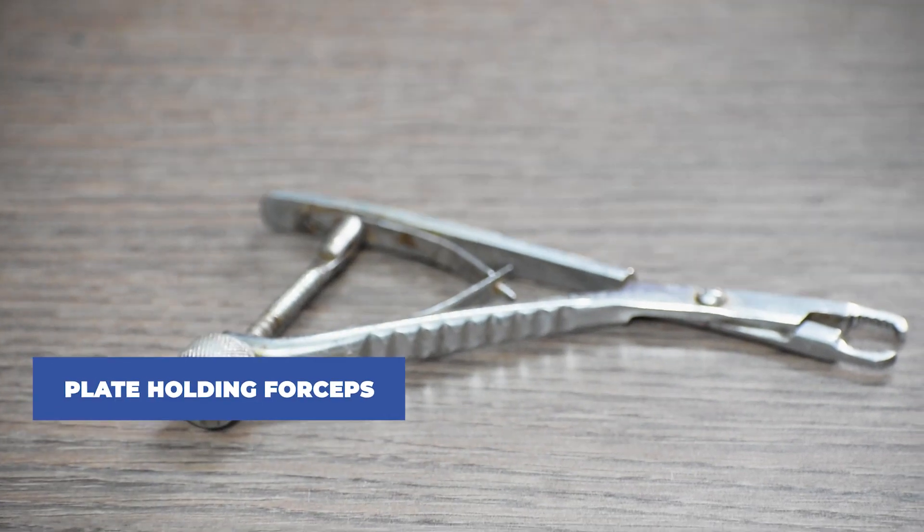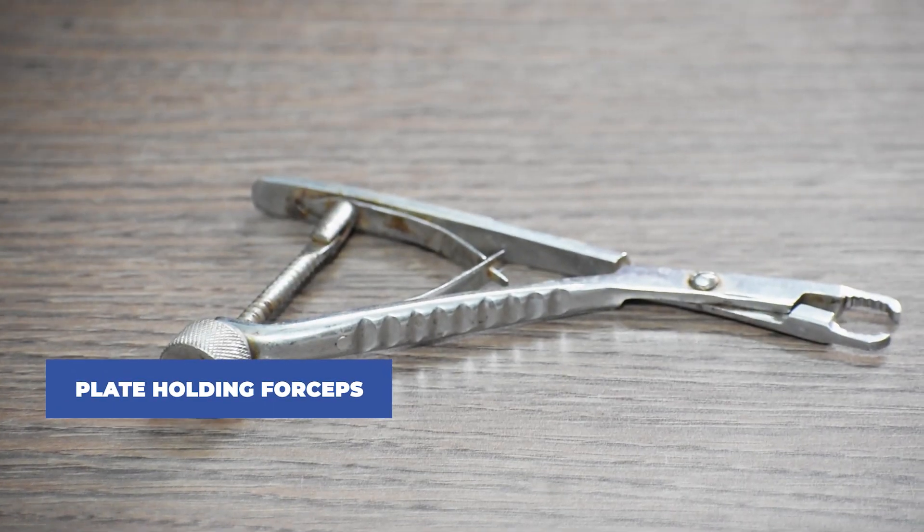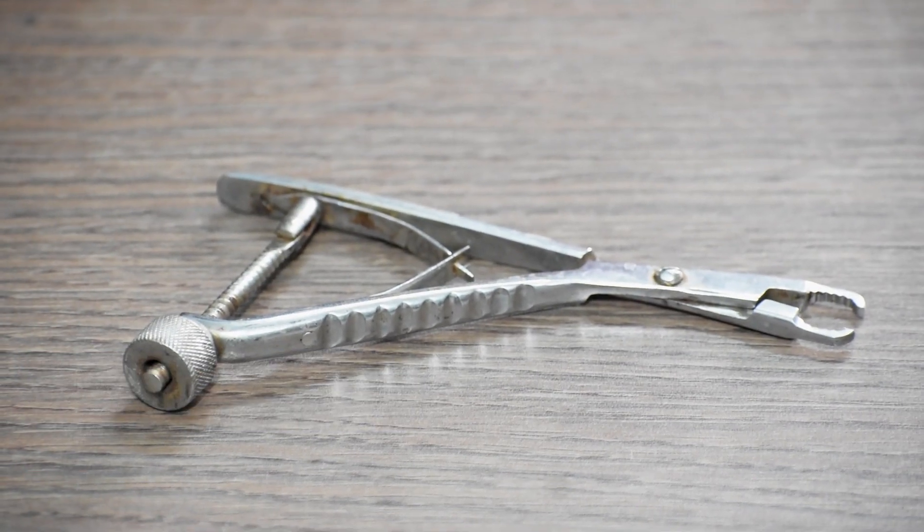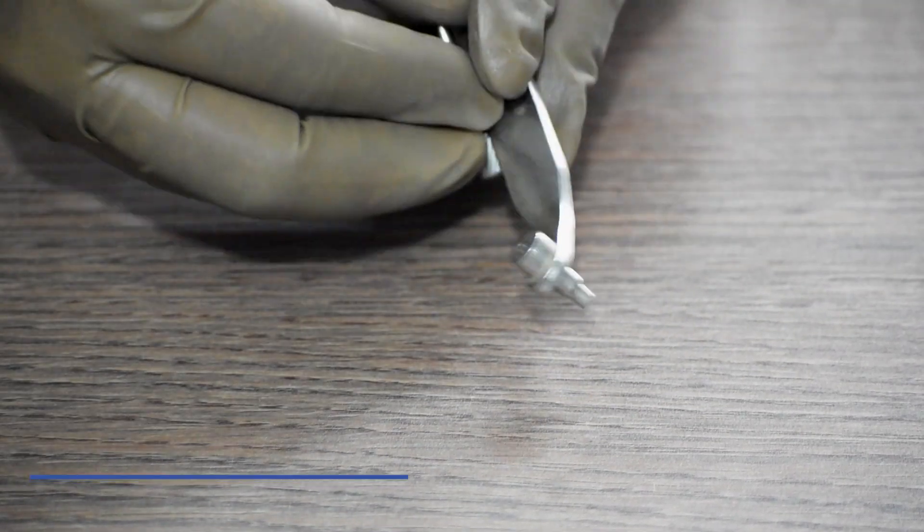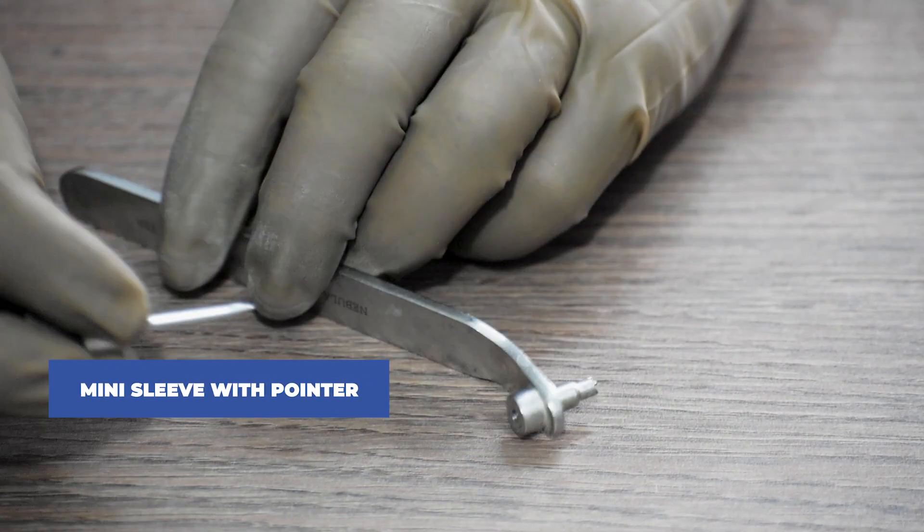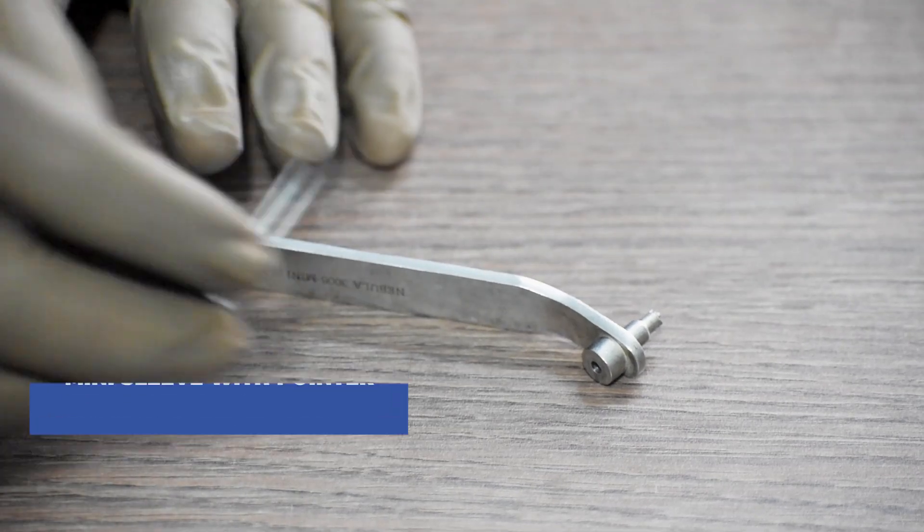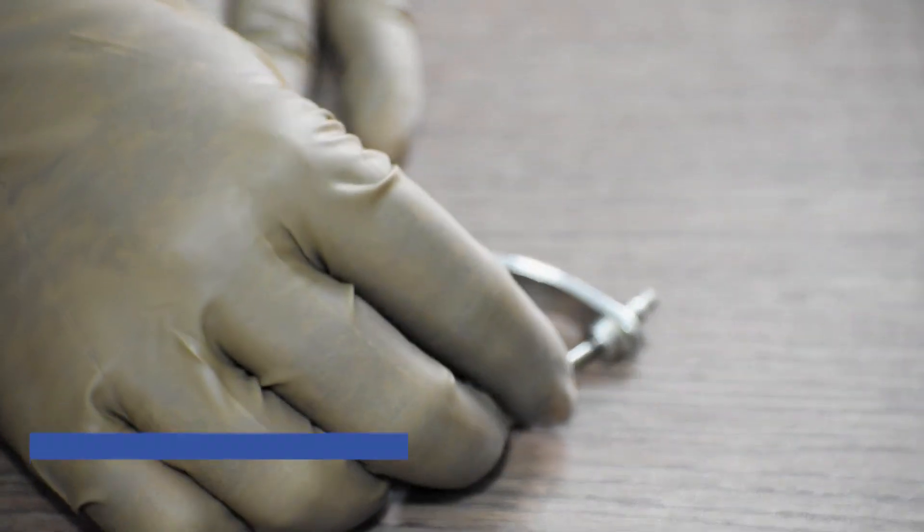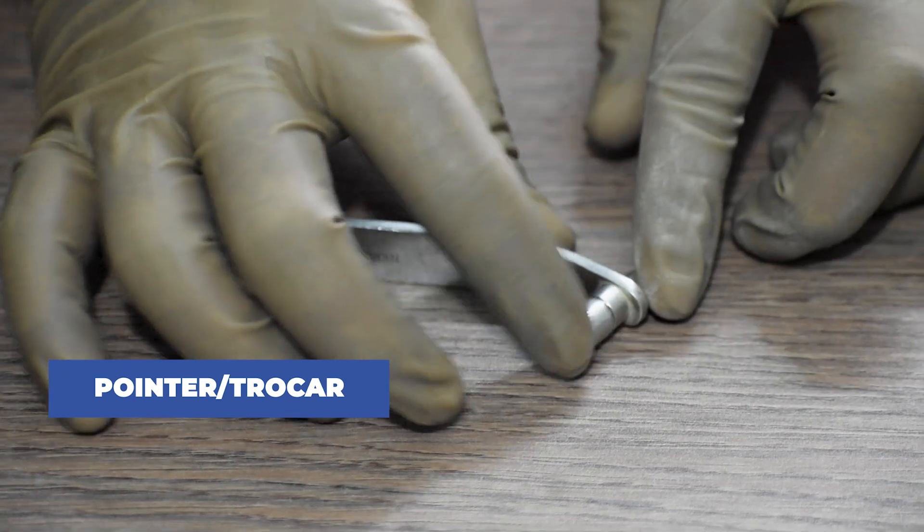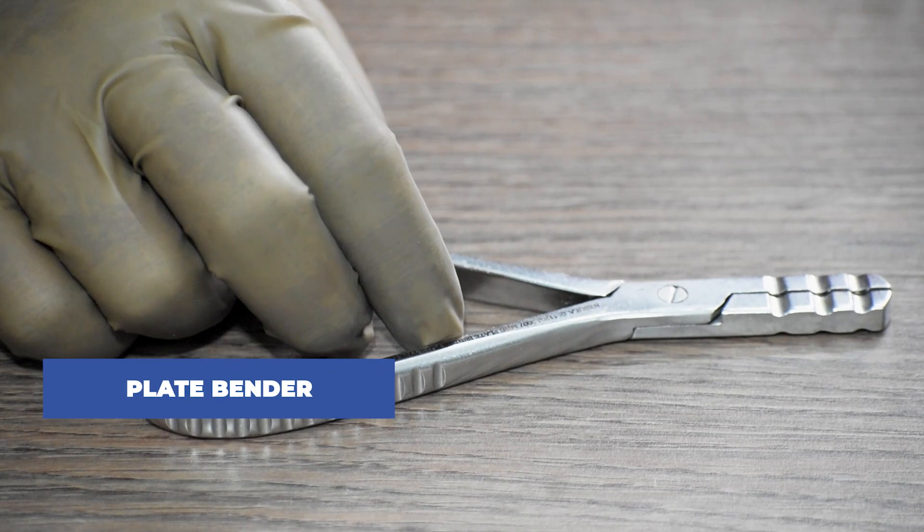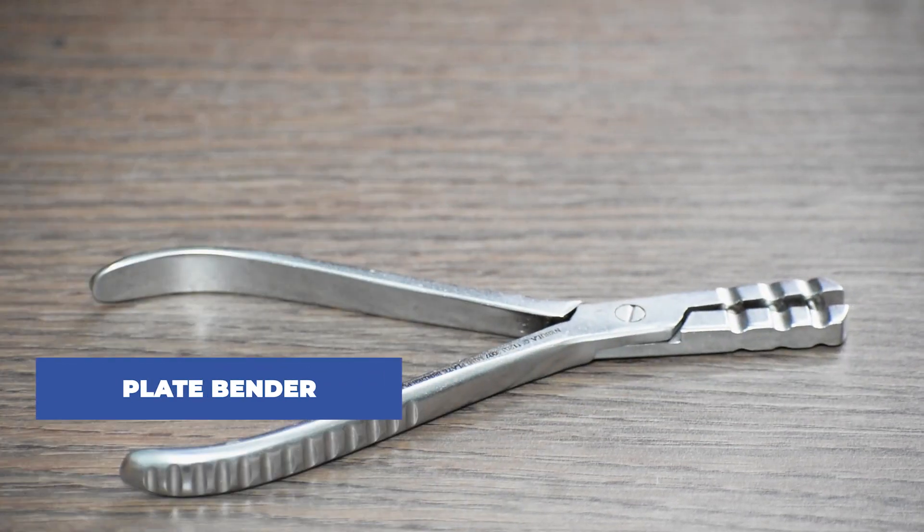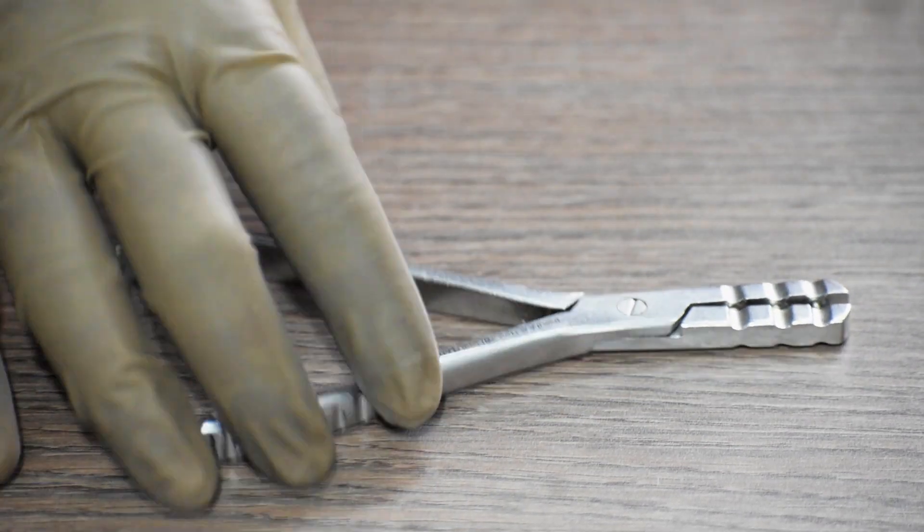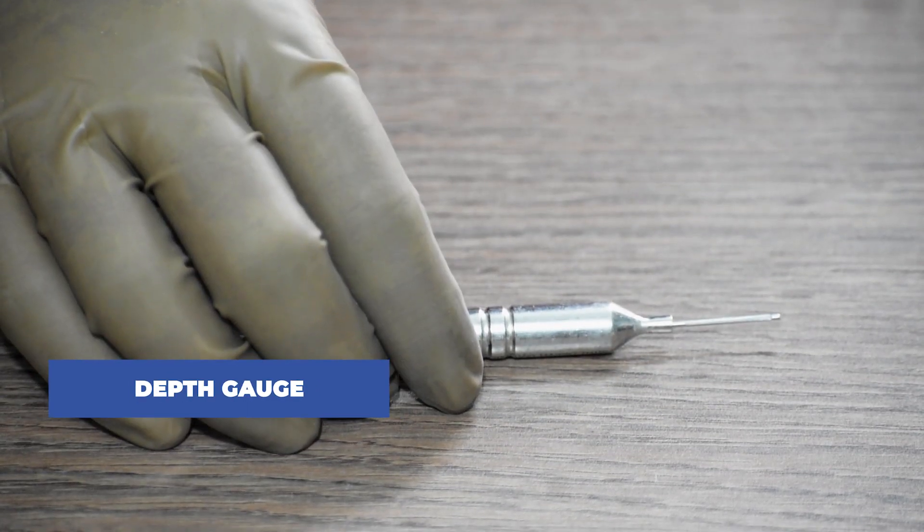Next, we will require plate holding forceps, mini sleeve with a pointer or trocar, plate benders, and depth gauge.